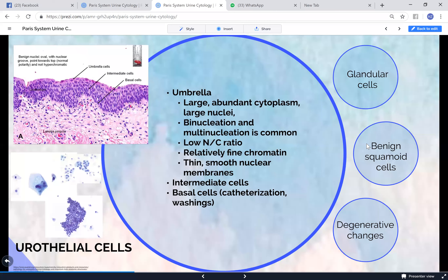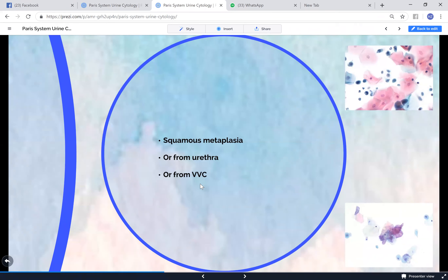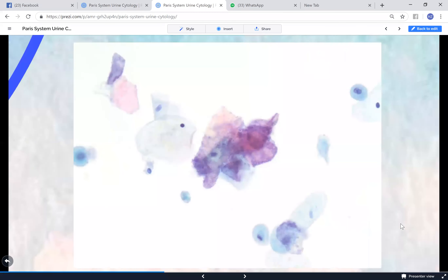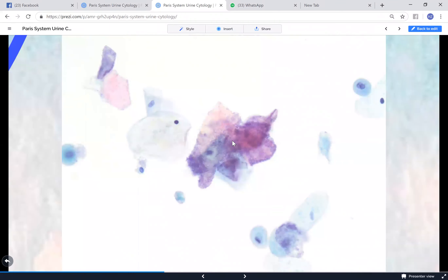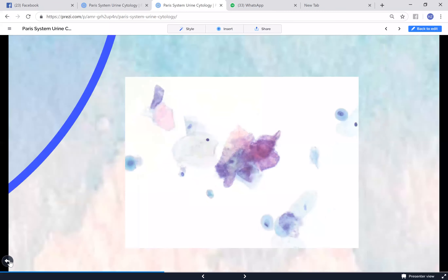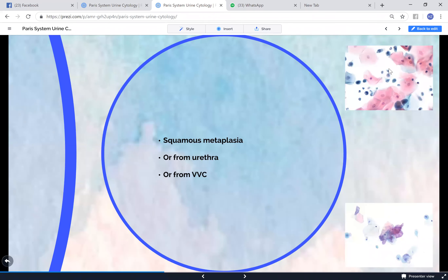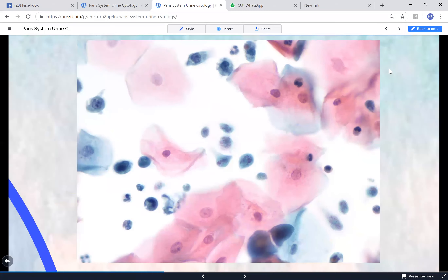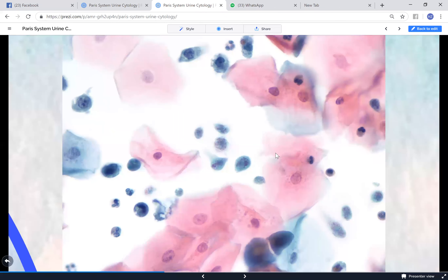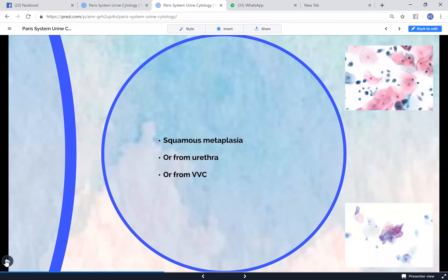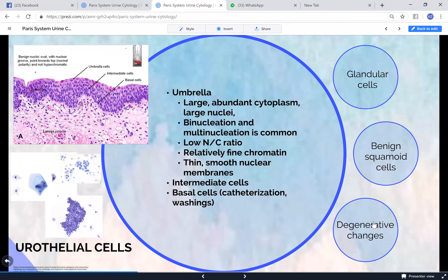Glandular cells that look benign are called negative for high grade - nothing to worry about. Squamous cells can occur due to squamous metaplasia, from the urethra, or from vulvovaginal contamination. You might occasionally see changes resembling low-grade or high-grade dysplasia as if it were a pap smear, but urine is not meant to be a pap smear so you should be very cautious before giving any such diagnosis. Trichomonas can also be found in the background.